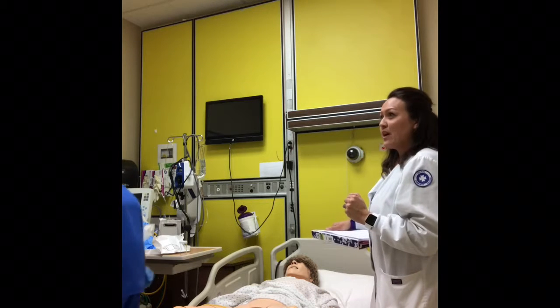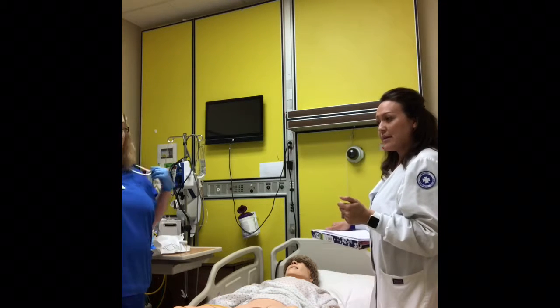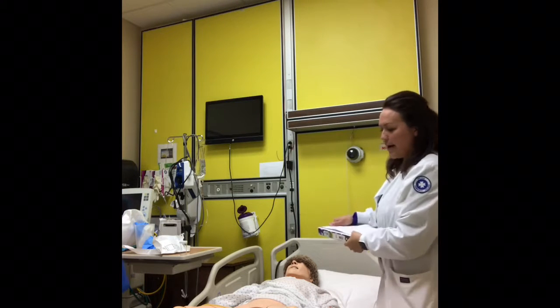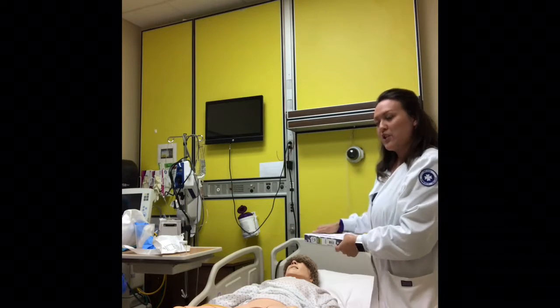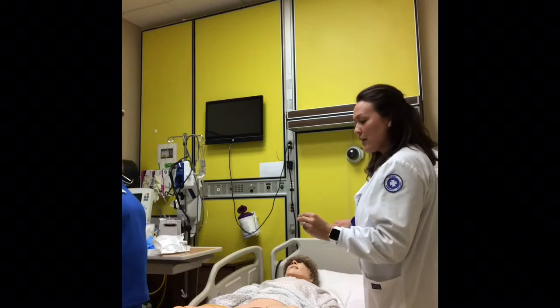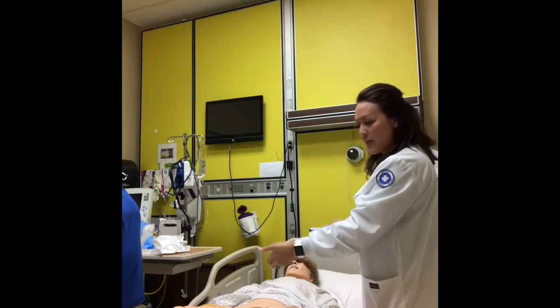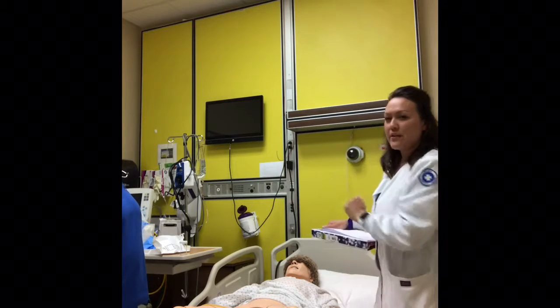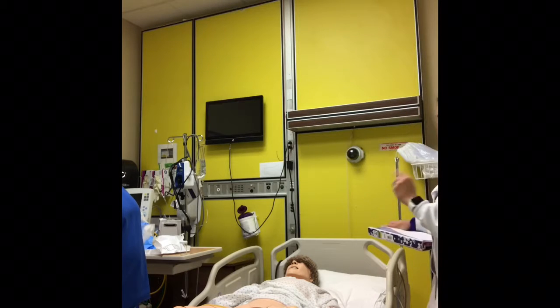And a helpful tip, especially with more obese patients, is really spreading the labia, and you want to look for that wink. So you can try again with the first attempt tubing in. You can see where you're at and then go maybe a little bit above to try to find that urethral meatus, and then you try again.